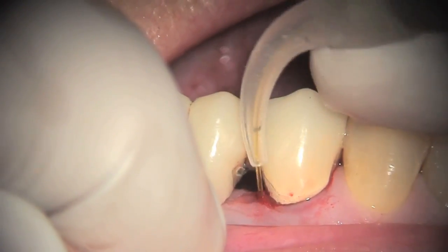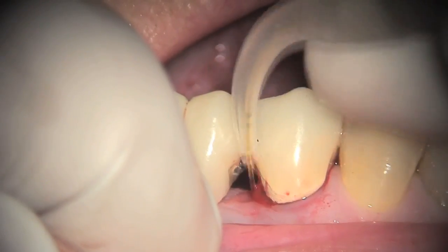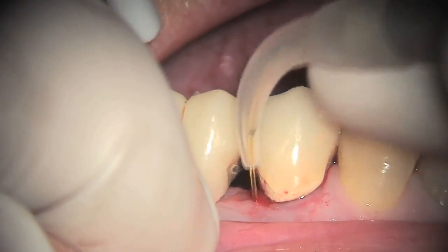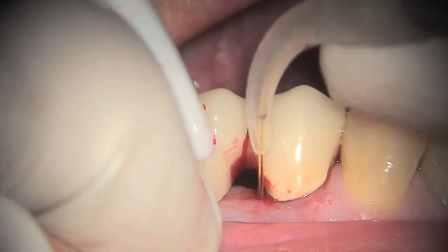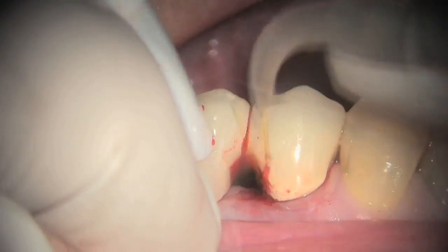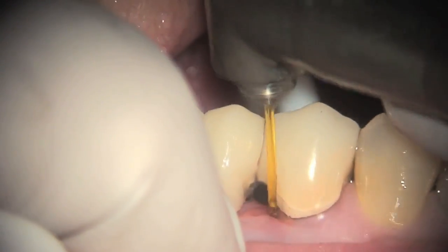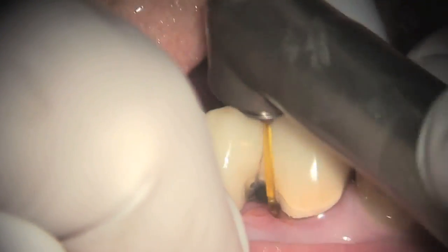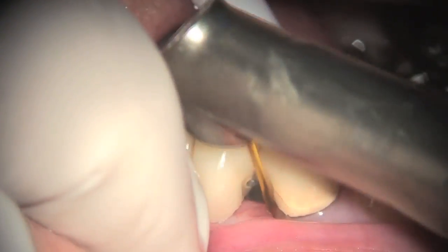If there is any residual epithelial lining left, this is the time that you would go in and remove it, although in the majority of cases this step is not needed. The fourth step is decontamination and surface modification of the dentinal surface, starting at the top of the sulcus and moving all the way down to the bottom of the pocket.